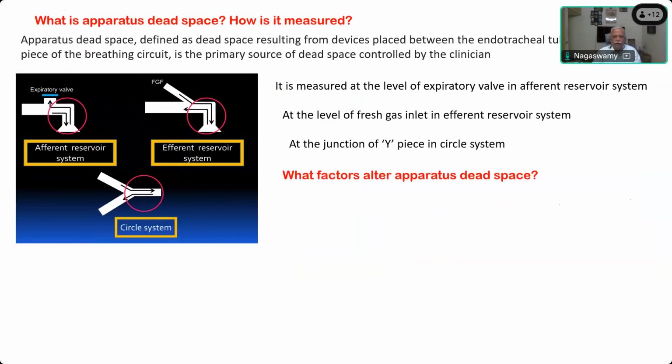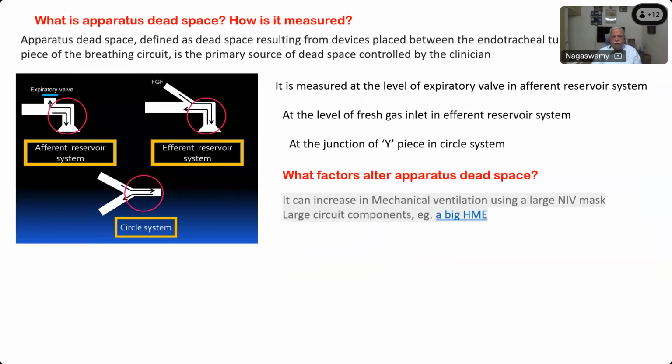So what factors alter the apparatus dead space? It can increase in mechanical ventilation by using a large non-invasive mask or a big HME.